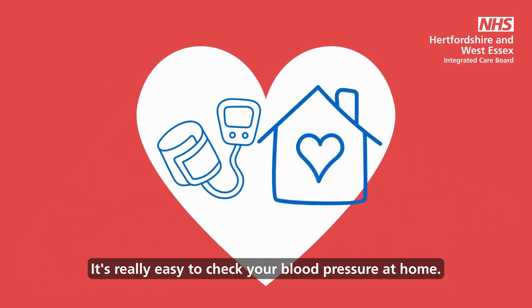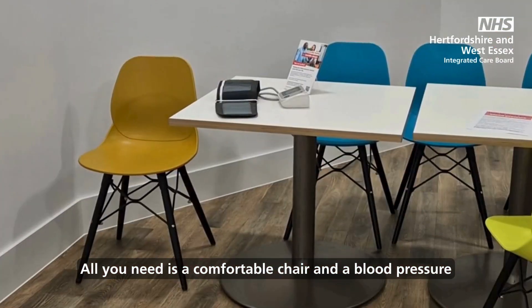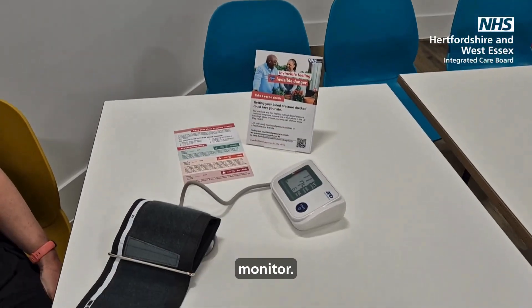It's really easy to check your blood pressure at home. All you need is a comfortable chair and a blood pressure monitor.